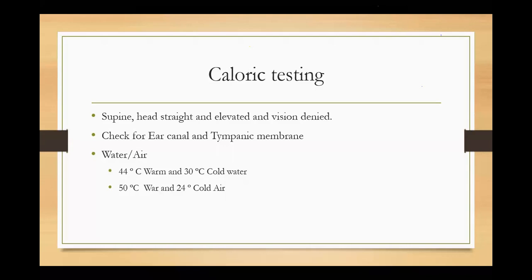So when you have a perforation or this grommet in the tympanic membrane, if you're pouring water into it, it will go into the middle ear and increase the infection, right? So we have to check the ear canal and the tympanic membrane, and it will help us either to terminate the caloric testing if we really cannot do it in case of earwax, or choose between water or air.